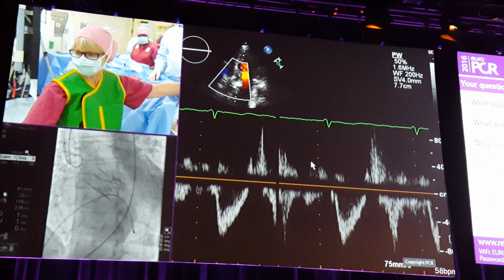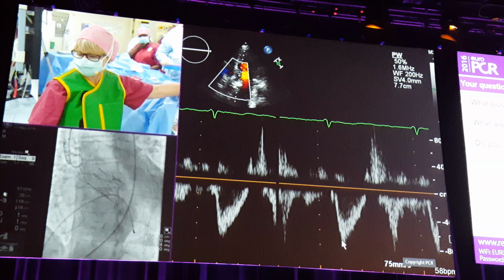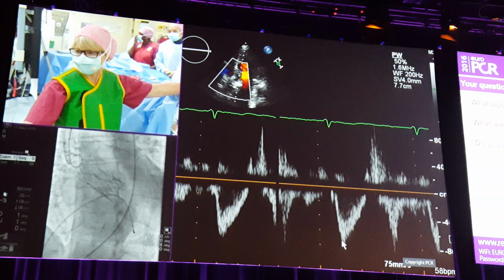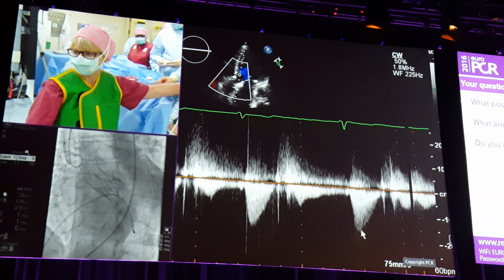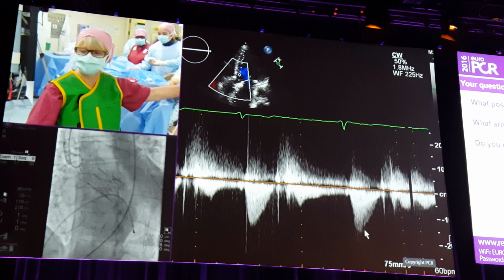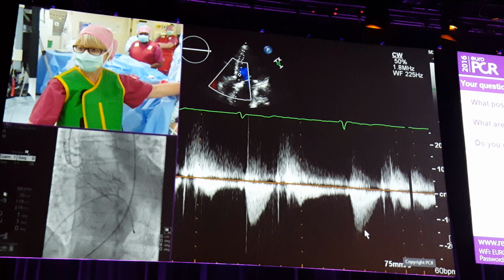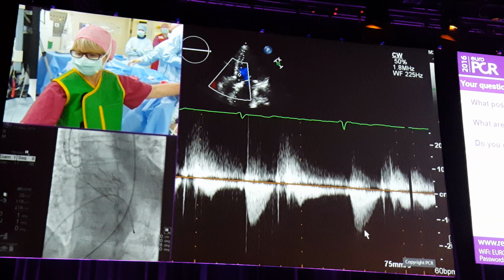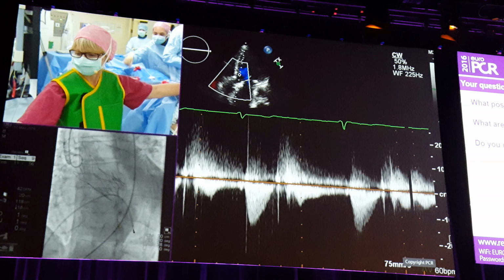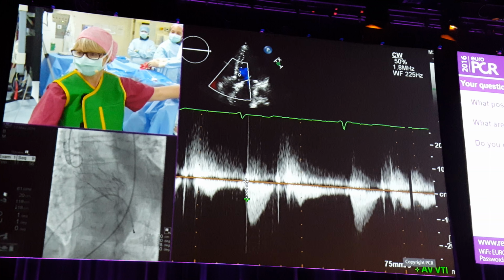So an excellent result. Although I haven't measured these yet, this is the LVOT velocity time integral, and here's the trans-valvular gradient. So these are going to be, again, very nice hemodynamics for this valve. So this lady's got a very good result. Great. And we need to keep in mind that this was heavily calcified leaflets, huh? Absolutely. Yeah.